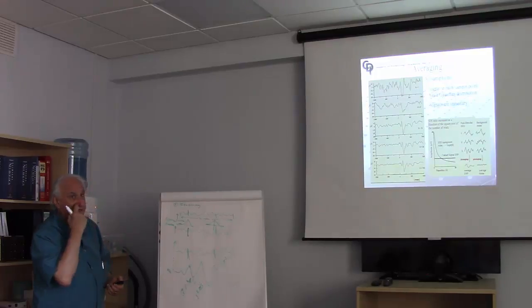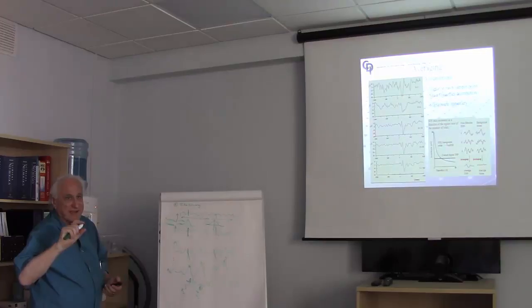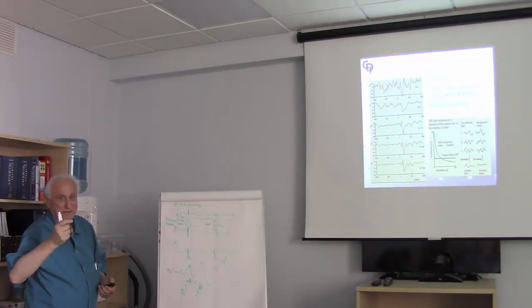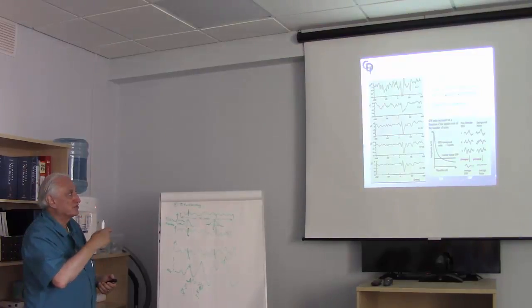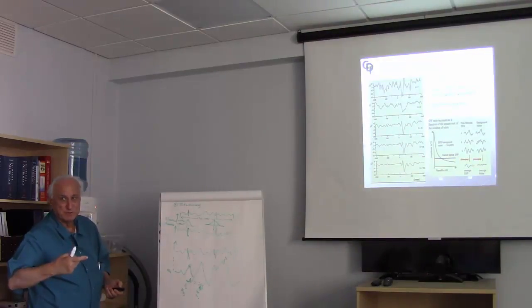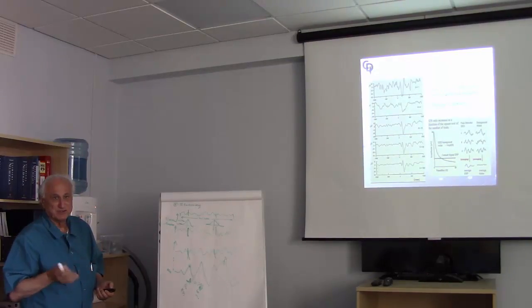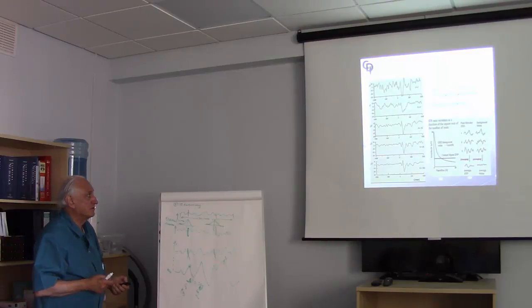Now, we do another calculation in our system that we play with, where, instead of averaging, we take a response, and then the next response we subtract it, and that gives us an estimate of the inherent noise. So you can not only compute the averaged response, but you can compute what the inherent noise is within the response. And that's helpful when you've got a very sick patient and you're trying to decide whether what you're following is real or not.